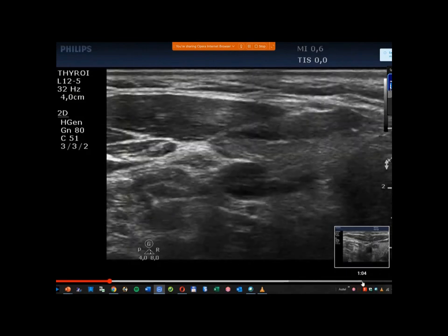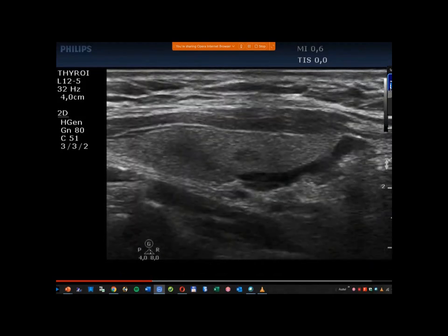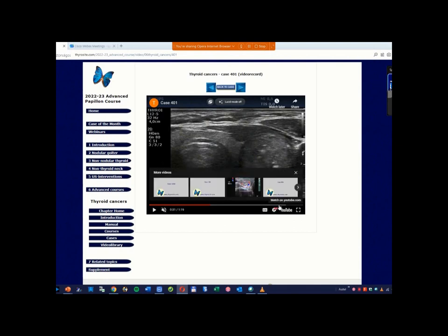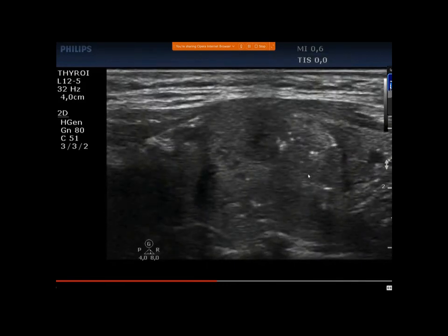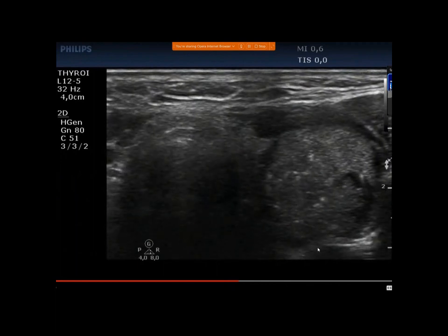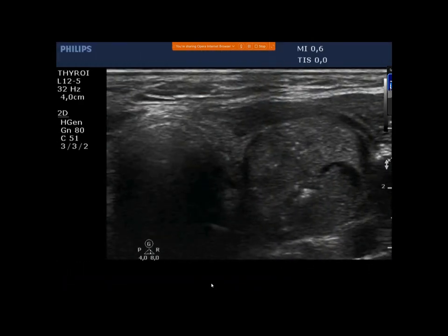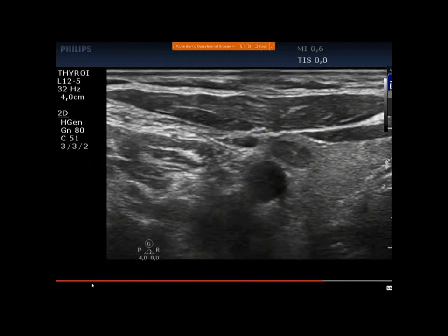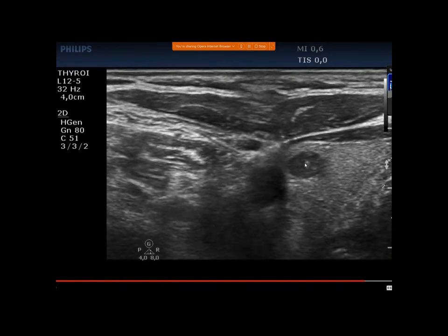I guess that I had one other case, but no video recording of this. When I started with my cytological practice, there was one more case. But this is that one. So it is worse. Reminding this pattern of amyloid deposit, quite specific, quite characteristic, this irregular isoechoic or echonormal shape which has some echogenic spots, seemingly microcalcifications, but indeed medullary cancer does not have microcalcifications. And here is the aspiration cytology of the papillary cancer focus in the right lobe.